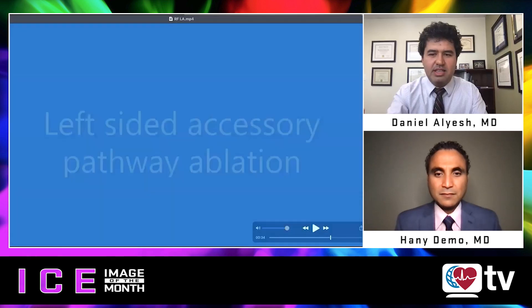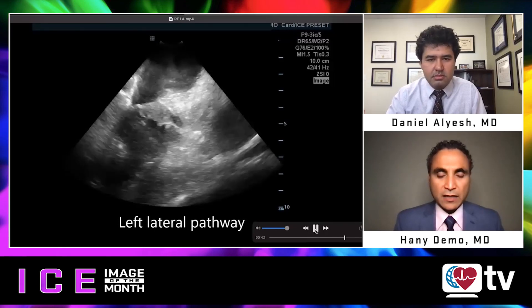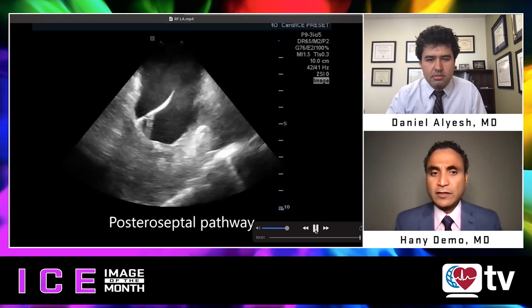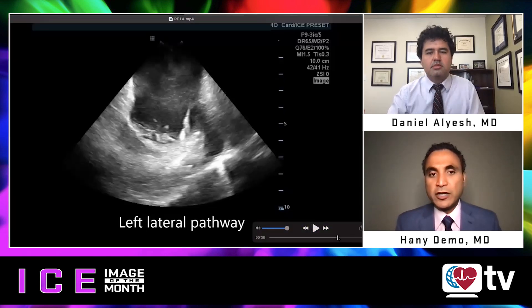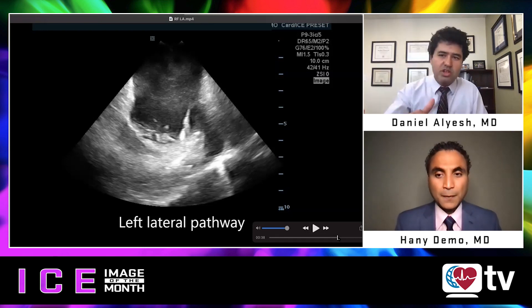Another nice application here is a left lateral accessory pathway at the mitral annulus. You can see very well the contact between the catheter and the atrial part of the annulus, and how close you are to the appendage — so you'll appreciate if your catheter jumps onto the appendage, avoiding potential perforation. You can also appreciate the tissue thickness and titrate duration and power based on the changes seen on the intracardiac echo images. You can ablate on the atrial or ventricular side of the mitral annulus using ICE. High power here is 50 watts.